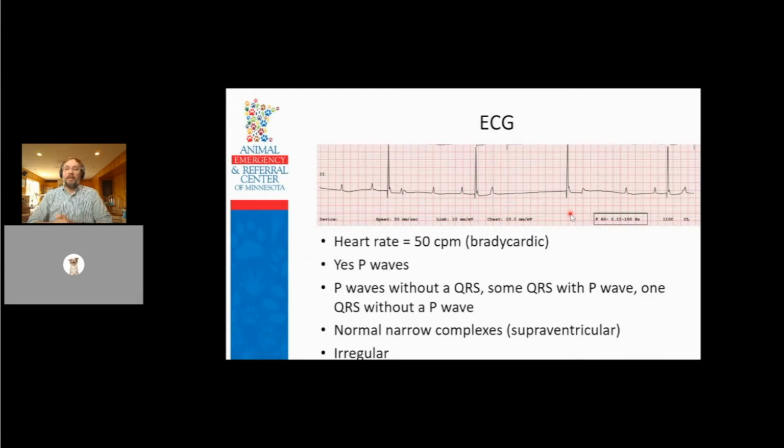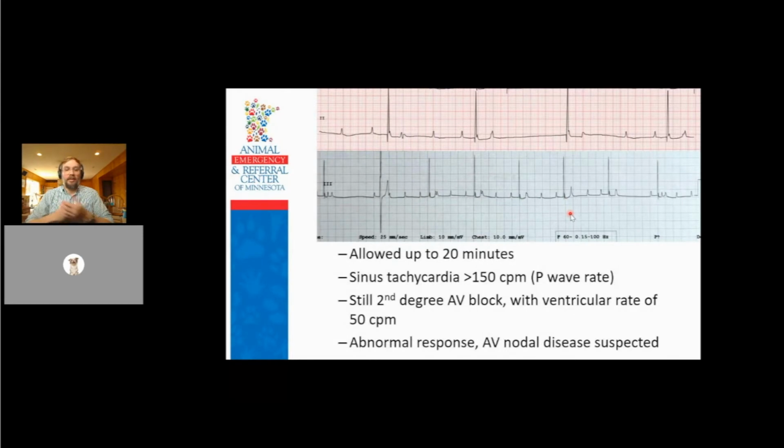And then, the question is, let's say this dog comes in with lethargy and diarrhea. Is this a bradyarrhythmia that's hypoperfusing the gut and they have diarrhea because of that? Or do they have primary GI disease causing the diarrhea, which is causing high vagal tone, which is then causing the AV block? So again, to try to sort out what vagal component there may be, I would do an atropine response test. And same thing, I gave 0.04 mg per kg IV.